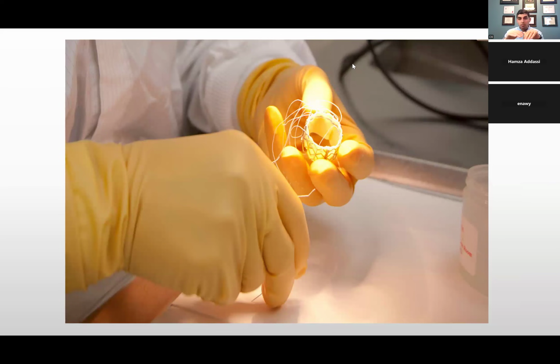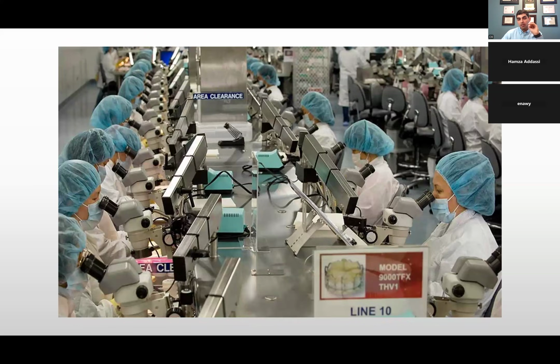Once they process the pericardium, they cut cusps out of it, and then they manually hand suture every cusp to the valve. This is how it's done, an assembly line pretty much. The valve starts on the top right here. They do some work, pass it on to the next person, and the next. By the time it gets to the last person, the valve is complete.